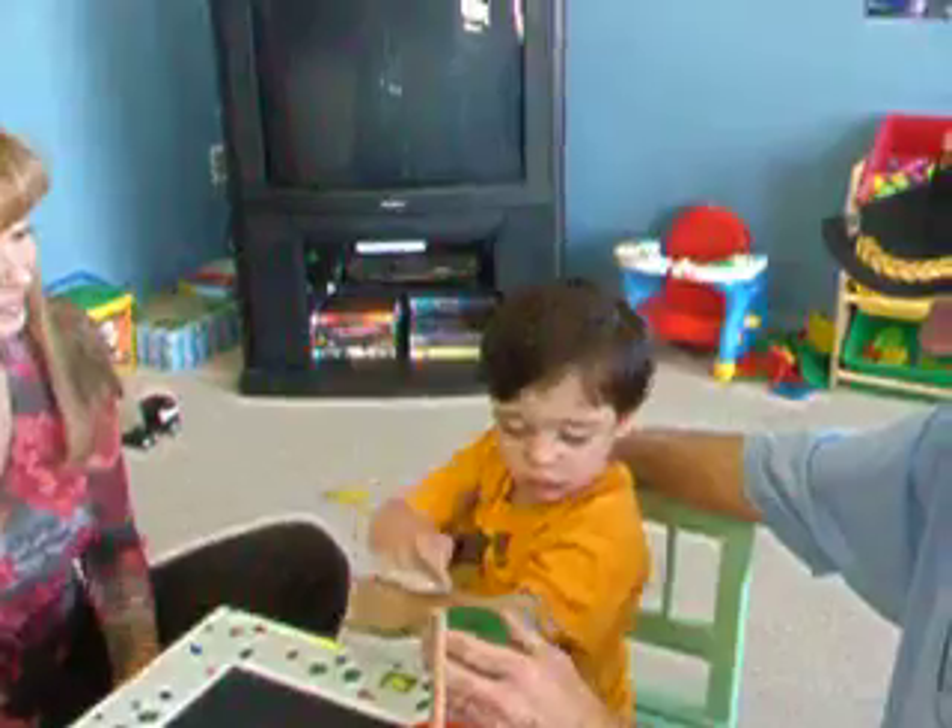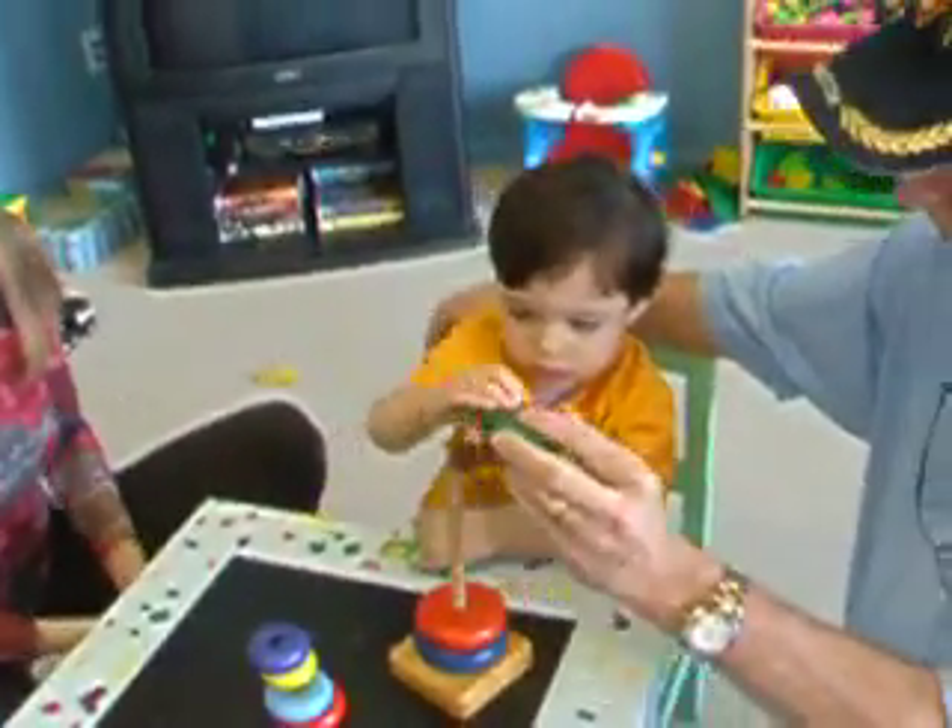Here you go. Look, look. Show mom how you did that. Oh, no. Use this hand. Just show her this hand.